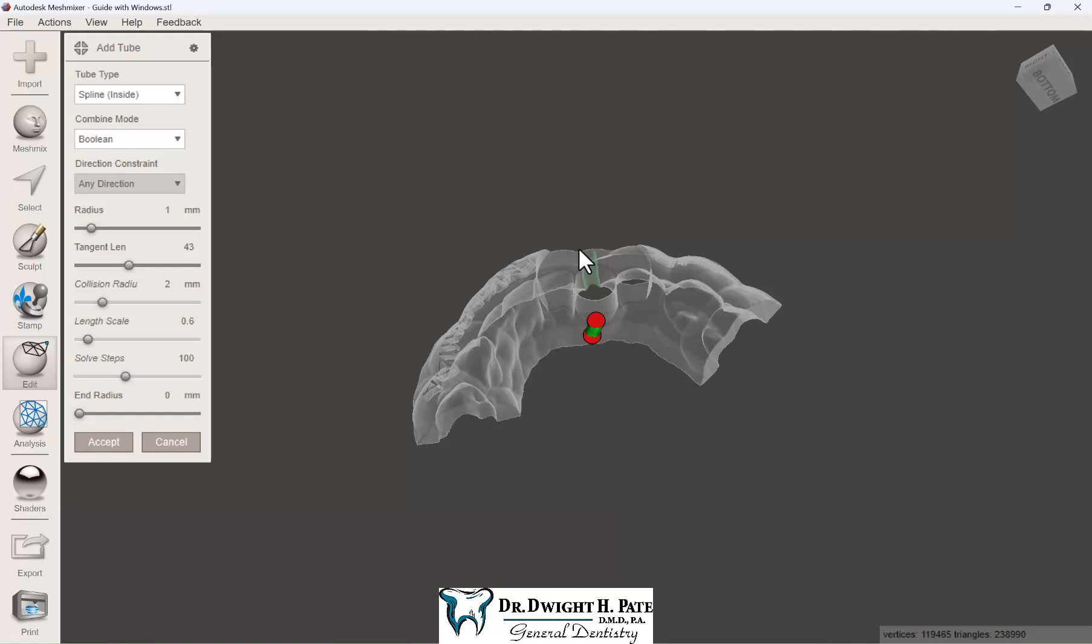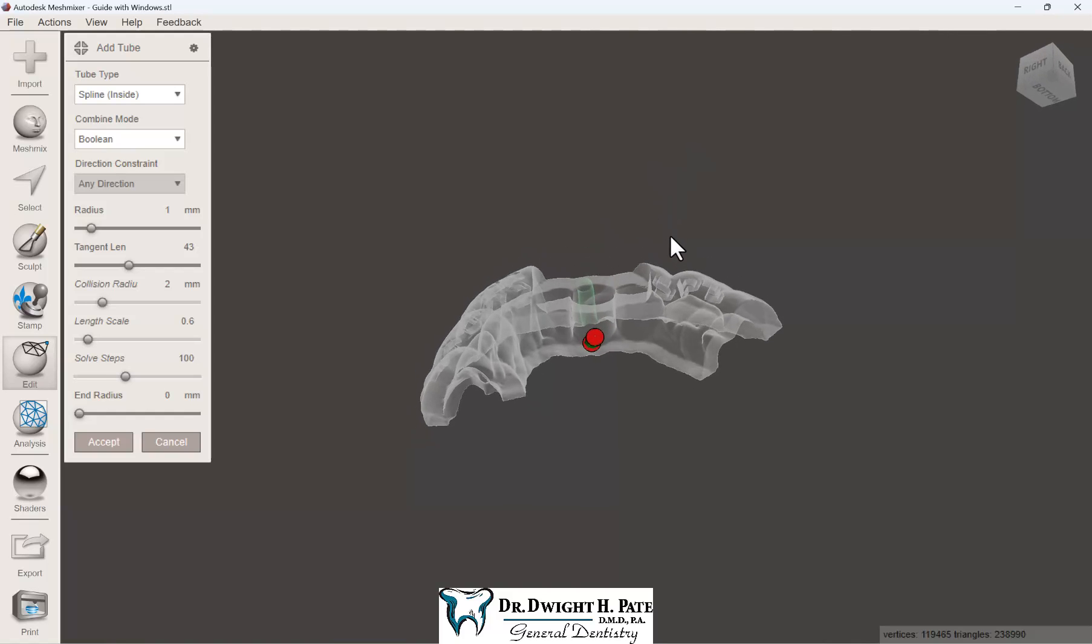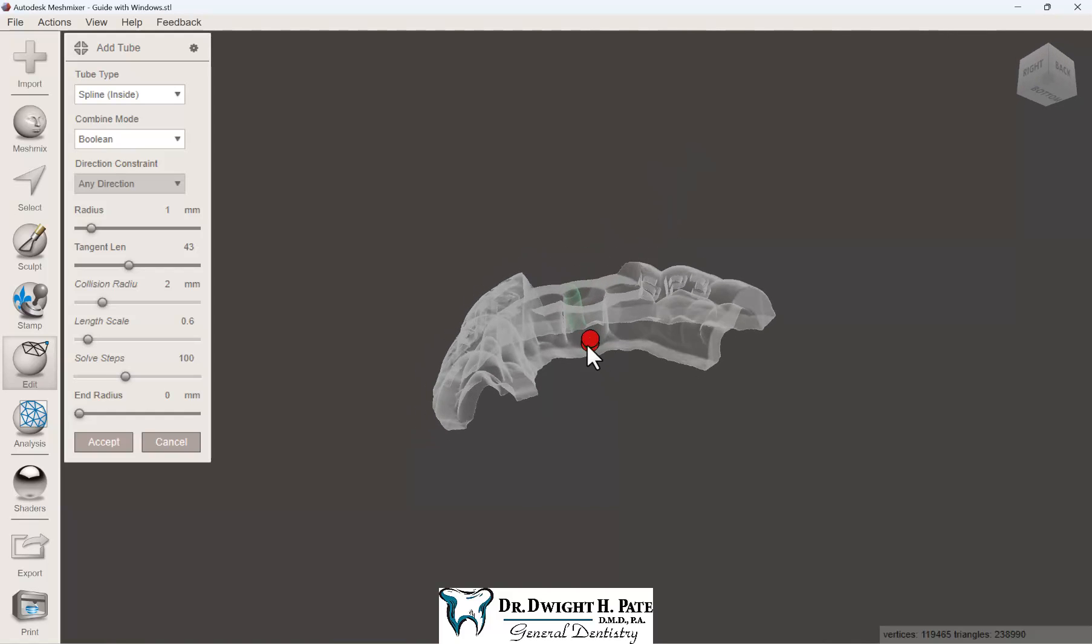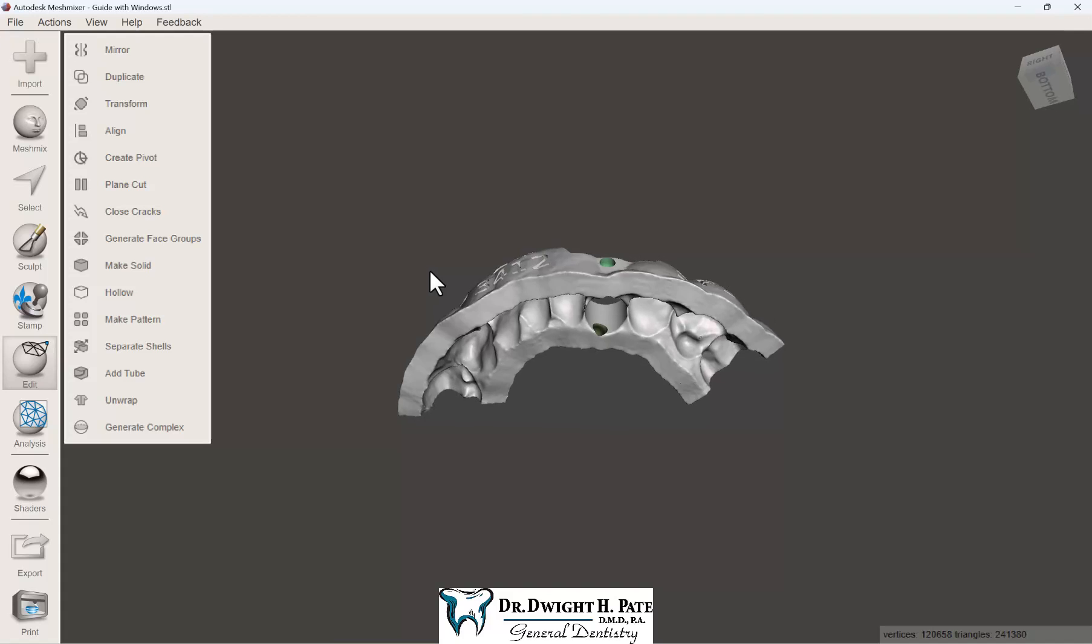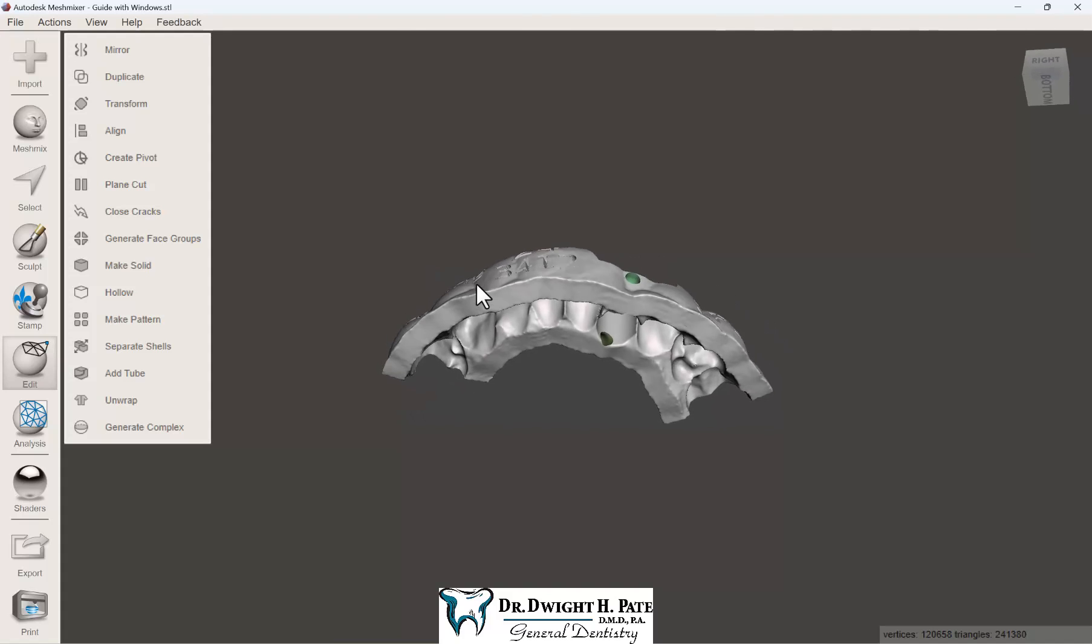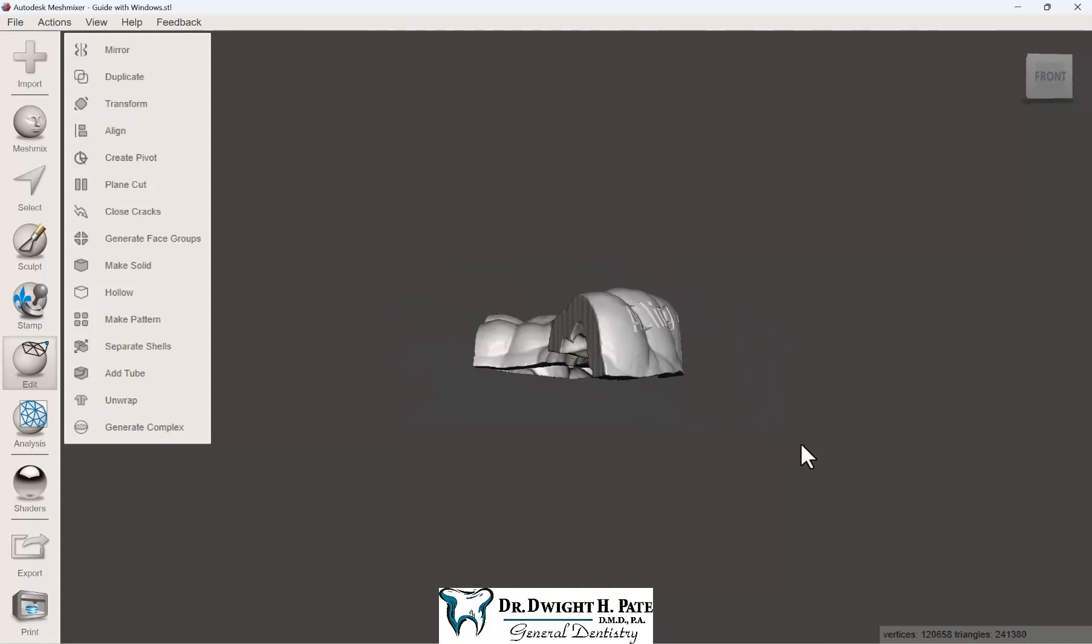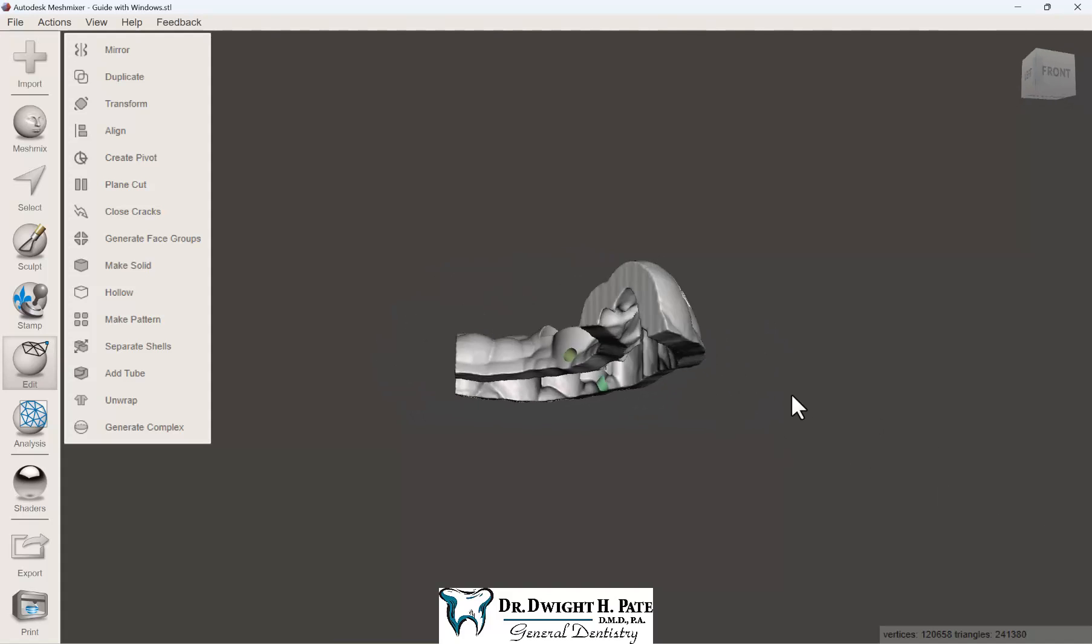These external irrigation channels give you the ability to keep the bone nice and cool while you're drilling. In this case, I'm putting one on each side.